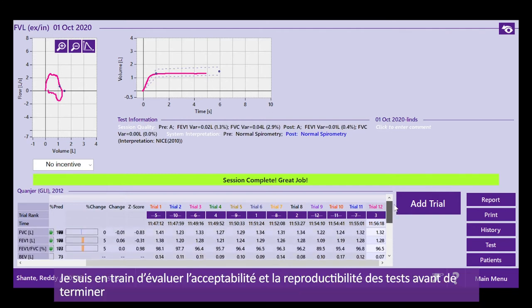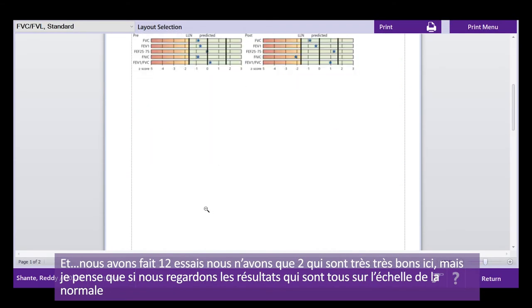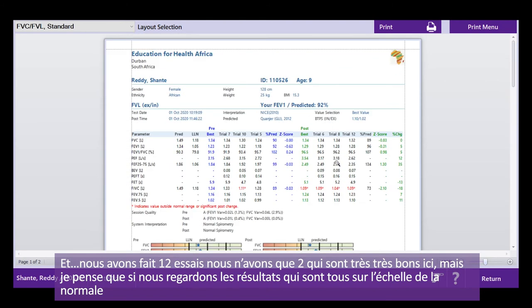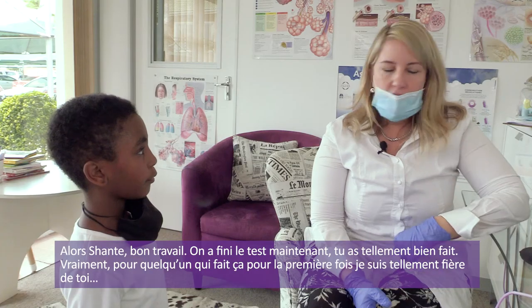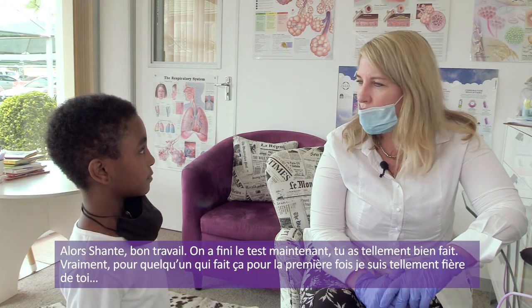So what I'm doing is assessing the acceptability and repeatability of the test before we conclude. And we've done 12 trials. And I think that we've only got two really, really good ones on the post. But I think considering the results, which are all normal, this is a normal spirometry test, I think that we can conclude this test. So Shanti, well done. We finished the test now. You did such a good job. Really, for someone who's blown for the very first time, I'm just so proud of you and what you've done.